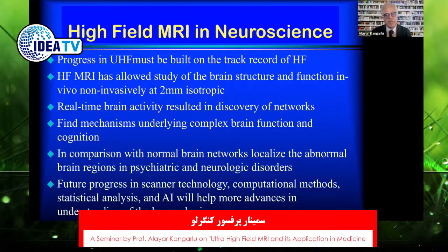So for instance, if you want to do functional carbon-13 imaging, you have the choice of using carbon-13 enhanced glucose and inject that as a contrast agent. And once that glucose, with basically all carbon-13 elements in its molecular structure, is taken to the site of the brain activity, then you have a very high concentration of carbon-13 with a good signature of MR.